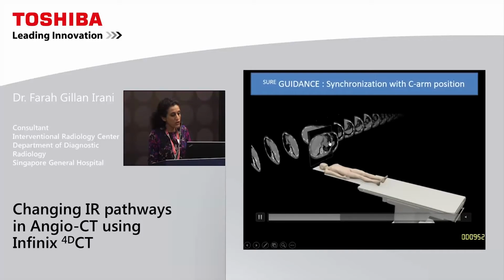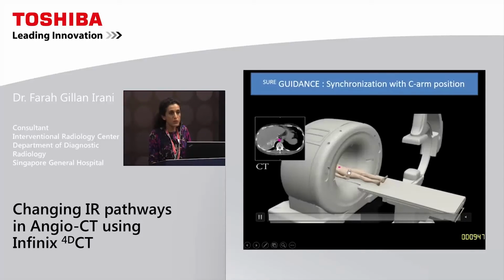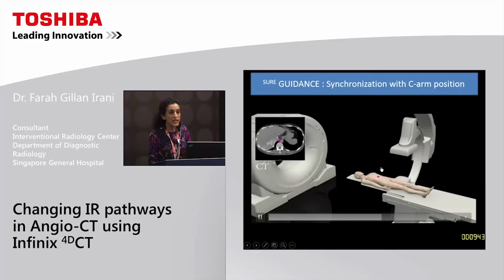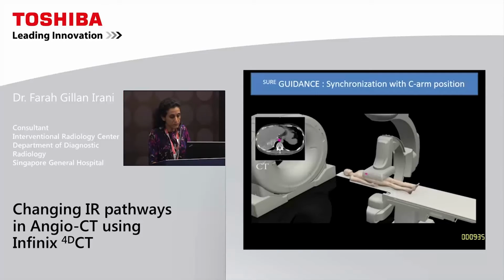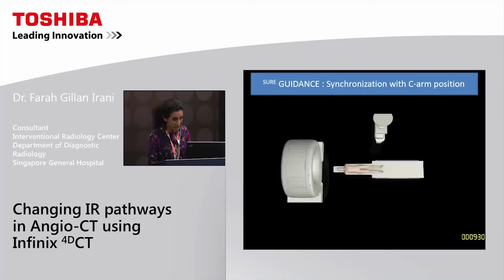So if I saw the gastric artery blush, I could just put a marker on that. That would mark the patient position on the skin. And with that, your fluoroscopy machine directly goes and docks in that position. So it's very, very useful in terms of ergonomics and flow. And if you move your table position, the CT scanner will follow that. These are some of the new features on the new machines that you will have.